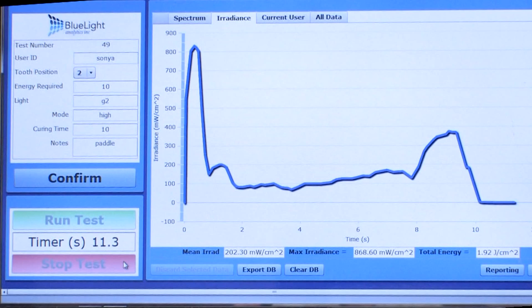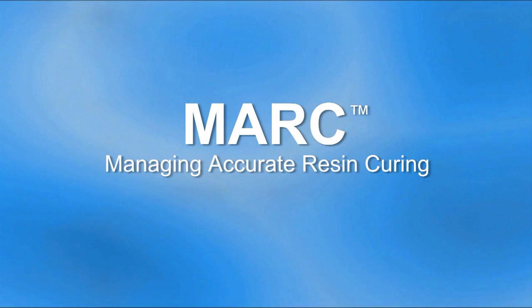As you can see, at the end of 10 seconds, using the same light as in the previous two clips, the dentist only delivered 1.9 joules per centimeter squared.